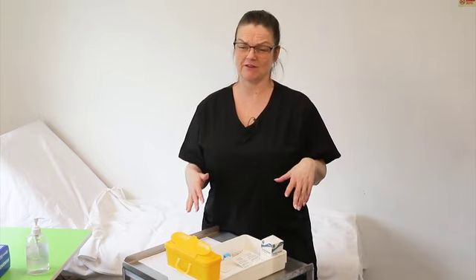So when you're about to give the injection, you need to pinch the skin, because it's a subcut injection. If you're pinching it, you're holding the fat together, and then the injection will go into the fat layer. When you're giving IM, you need to stretch the skin. If you don't do that, they will say it's wrong route. So sometimes I see nurses not touching the skin at all and just giving the injection. That's not good practice, and it will get you failed. So if you're doing this particular station, subcut, they want to see you pinching the skin.